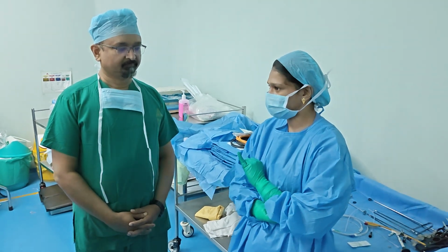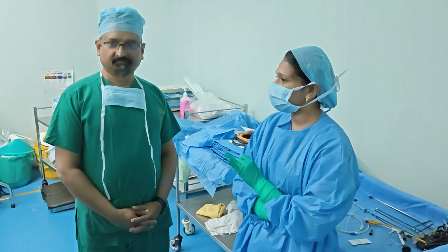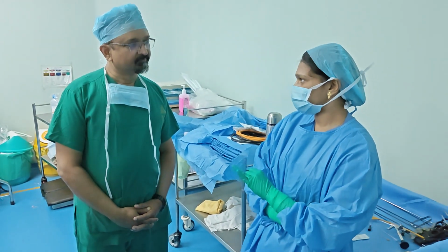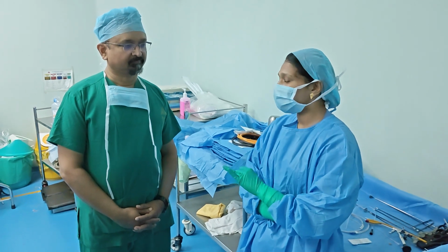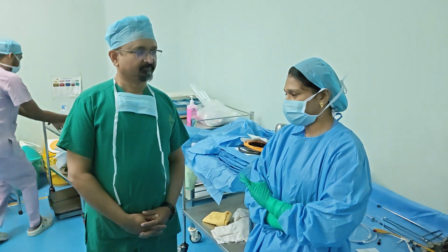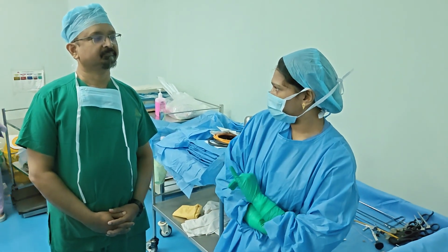First, we have to arrange the monitor. The instruments depend upon the age and weight of the patient. If it is below 5 years, we have to get 3 mm lap instruments. If it is above 5, we have to get 5 mm lap instruments. Then instruments for breathing we have to prepare.